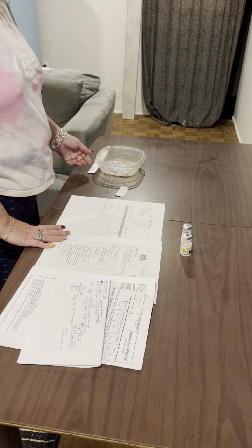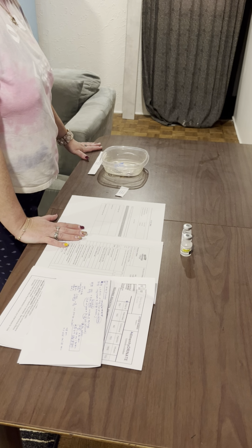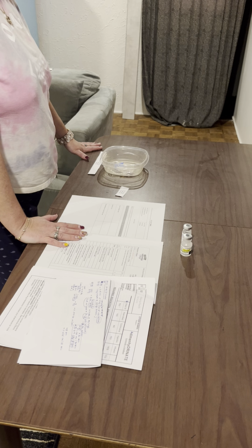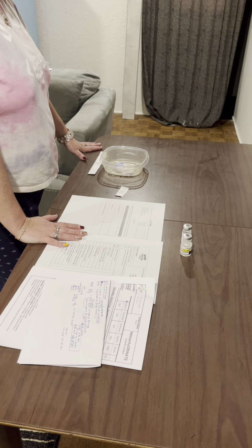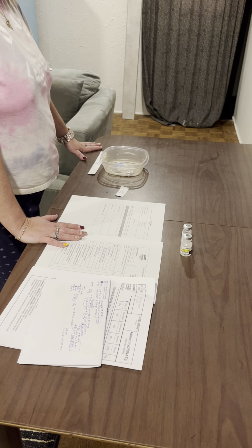But again, we would tell the patient just to watch the IV site after we've given the medication to ensure again there's no redness or puffiness or coldness or anything like that. We would ensure the patient's safety, make sure the call bell's in reach, and the patient knows to ring us if they feel nauseated or dizzy at any time with the medication, answer any questions they may have about the medication. And that would be the end of the IV direct medication video.